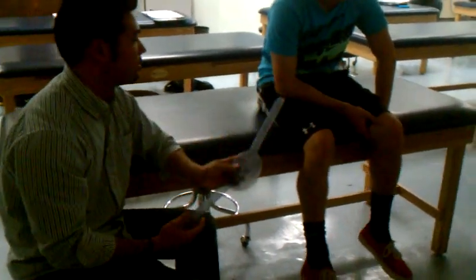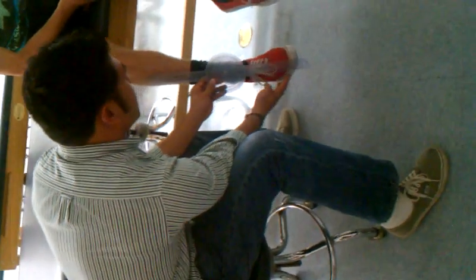Inversion and eversion is the last one — very simple but you'll be furthest from the body. It's difficult to keep the goniometer lined up on the foot because you'll break the curve. Your visual landmark is going to be between the two malleoli. It's lined up with the tibial tuberosity. For inversion, bring the inside of the big toe as far across the body as possible while keeping the leg straight — and you line up with the third metatarsal.